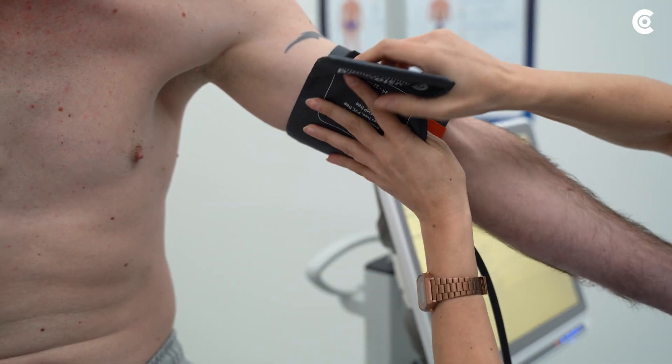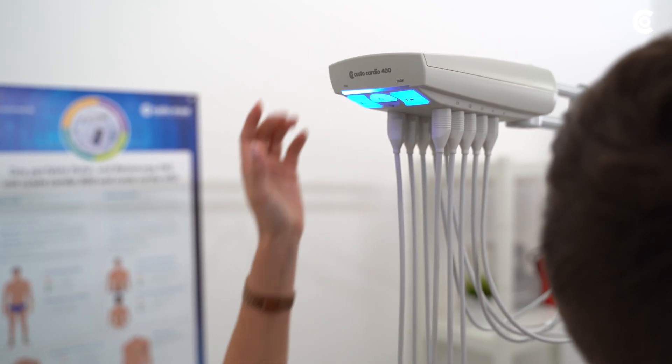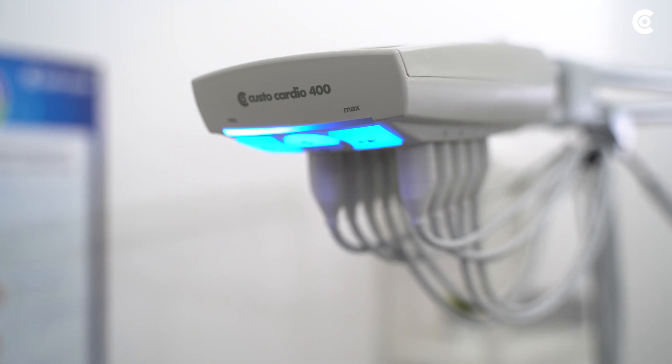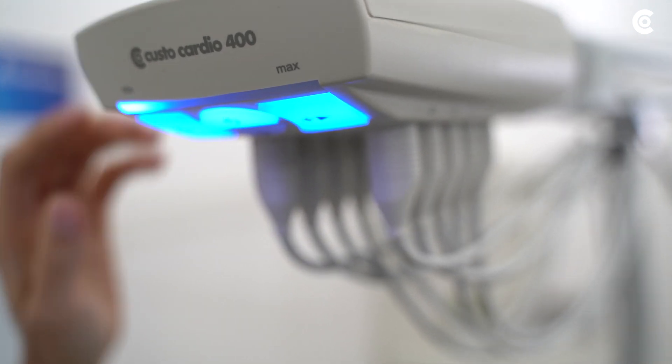Next, apply the blood pressure cuff and turn on the suction pump of Cardio 400. If you reduce the suction capacity of Cardio 400 manually, this may result in badly fitting electrodes on the patient and thus in signal artifacts in the ECG.